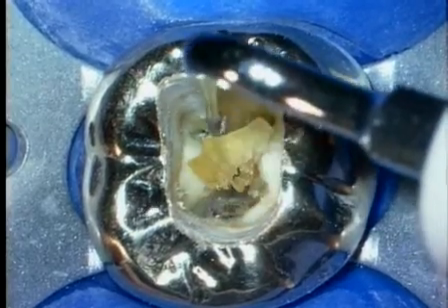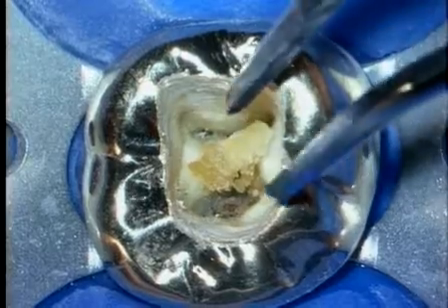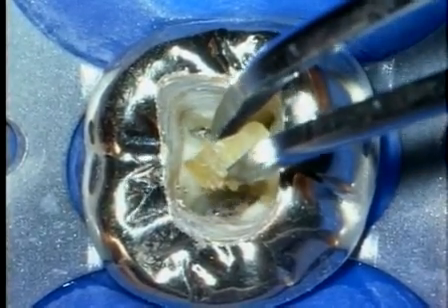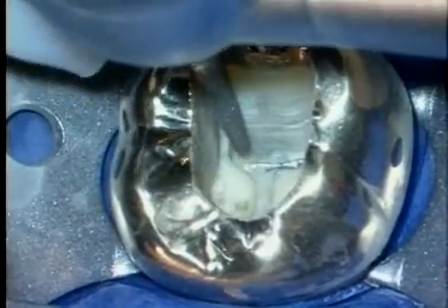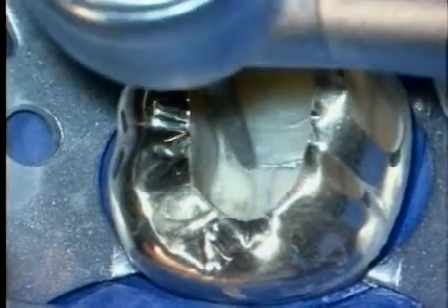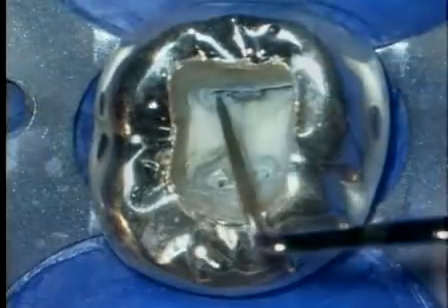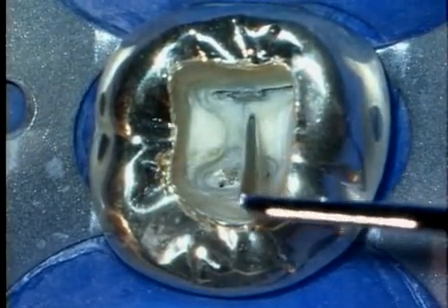You can see this thing is large, not only in terms of its mesial, distal, buccolingual dimensions, but notice its thickness. Once the stones liberate from the pulp chamber, diamonds are used to progressively refine the access. Notice the angle of the Explorer. This lets us know a little bit more about the underlying anatomy.